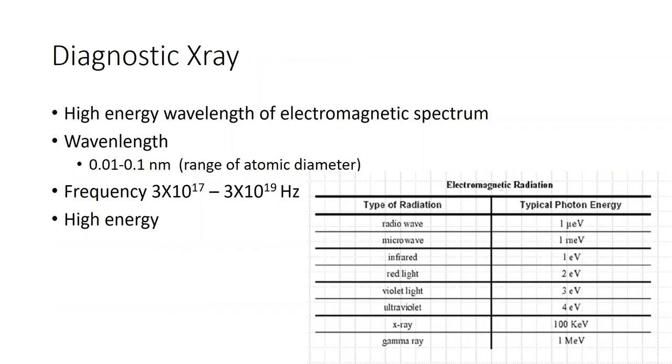Okay, basically this particle needs to bounce off or transmit around the atoms at the nuclear level. So these are wavelengths of 0.01 to 0.1 nanometers. And if you think about the size of an atom, you're talking about on the order of angstroms, which is 1/10 of a nanometer, right? And so this is what's going to actually, in its wave, hit and bounce off of a proton. Okay, and we know that there are certain types of nuclei that probably shield us well from X-rays. Give me an example of something that shields well from X-rays.